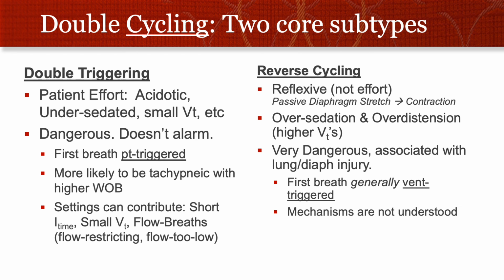Now, reviews that look at these two phenomena and compare the frequencies suggest that reverse cycling accounts for about 1/3 of the double cycled breaths in an average patient. But interpreting waveforms is in its infancy because it involves such an amount of computational power. And so there's more we need to learn about these things.